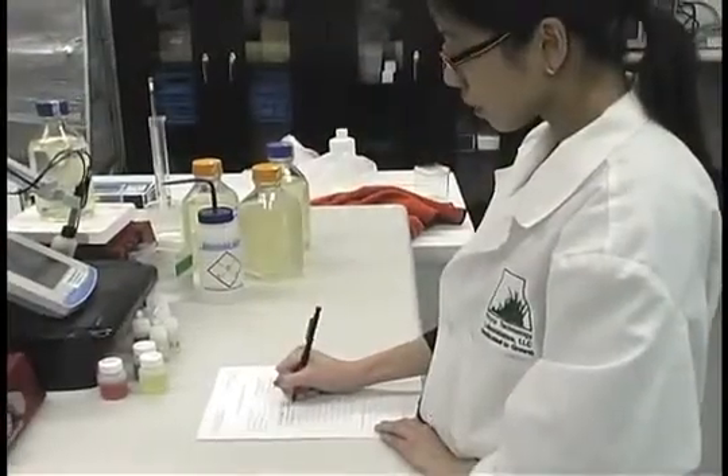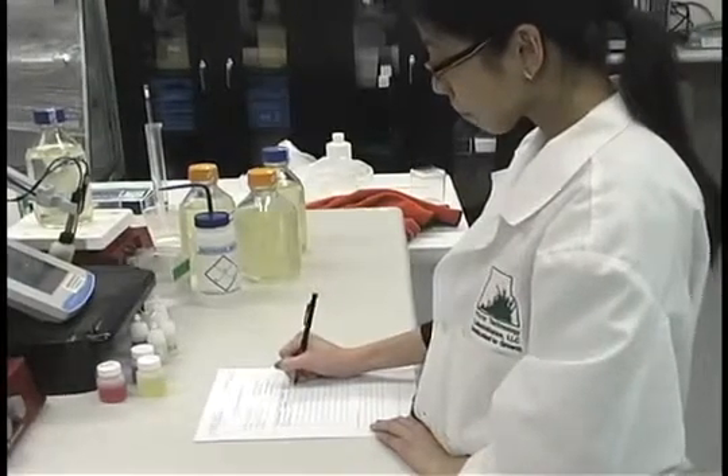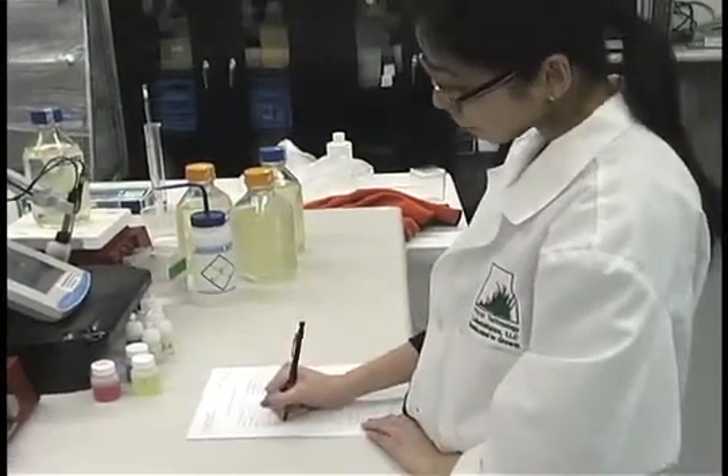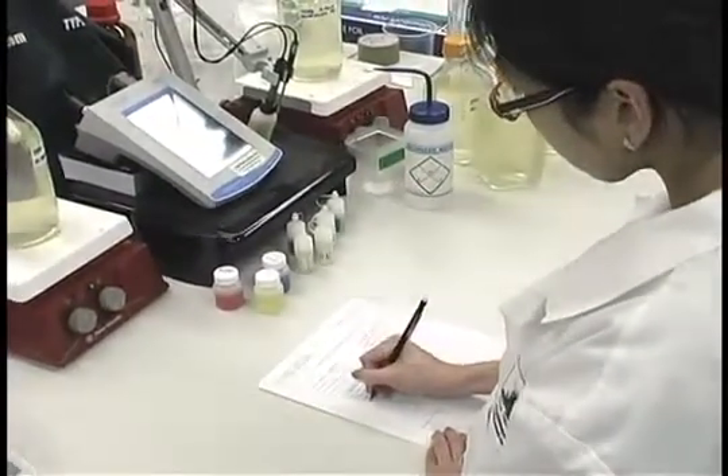We recommend that you write down each product and product lot number that is used when preparing media. A sample media log preparation form can be found on our website at www.phytotechlab.com.